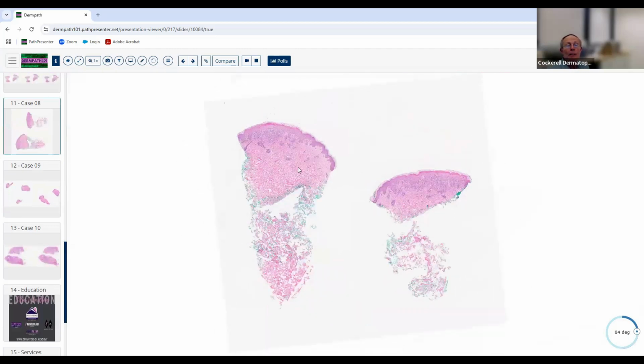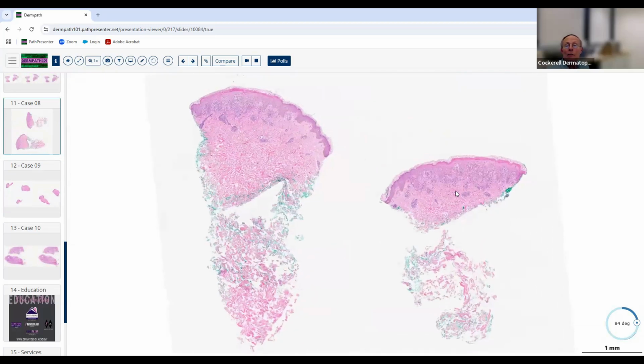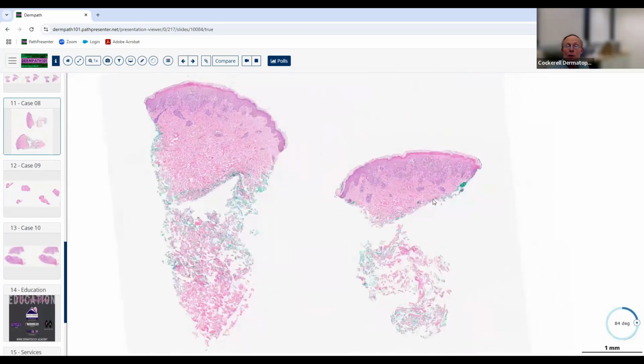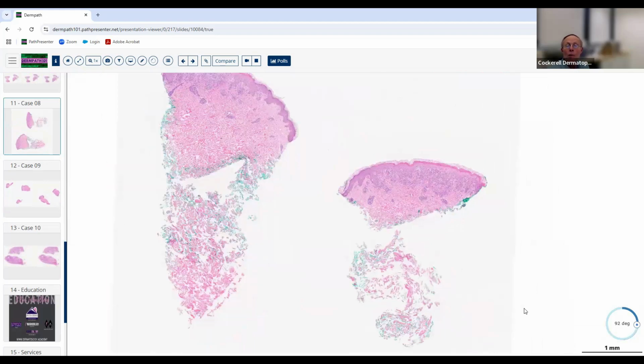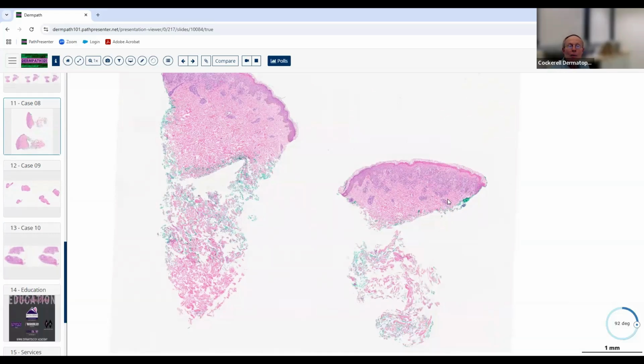Another punch biopsy, and we got two pieces of the tissue, but I think it may actually give you a little better view on this side over here. So in low power, it looks like an inflammatory process. We don't see any neoplastic cells here, nothing that looks like the metastatic renal cell or the Merkel cell carcinoma we saw earlier. We've got an inflammatory process that's mainly superficial perivascular dermatitis here, maybe superficial and mid, goes down to the mid-reticular dermis, but not deep.